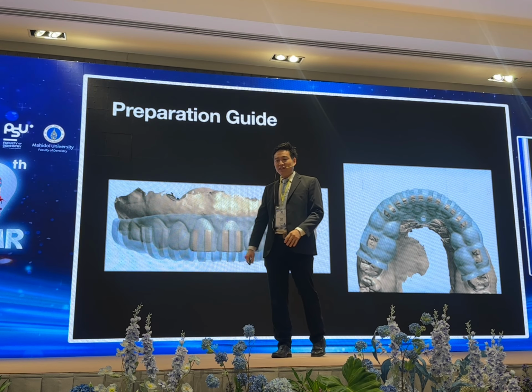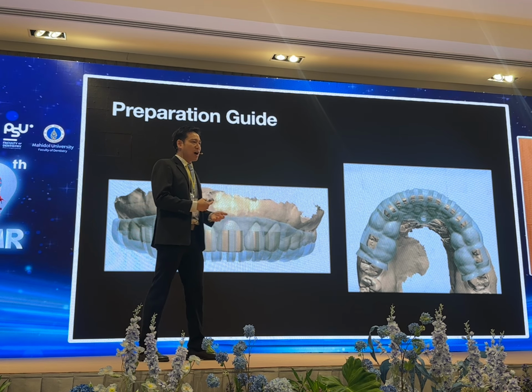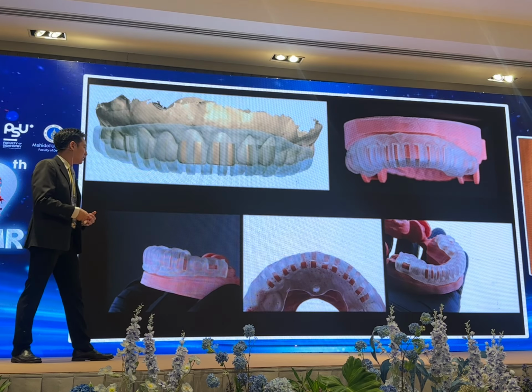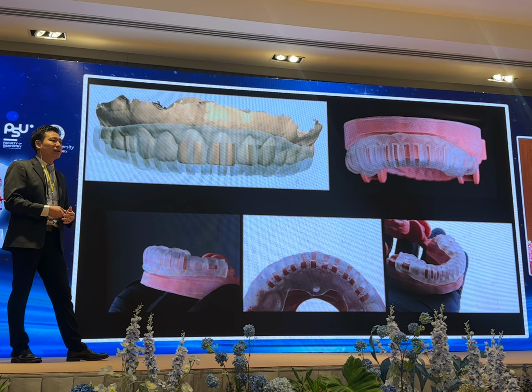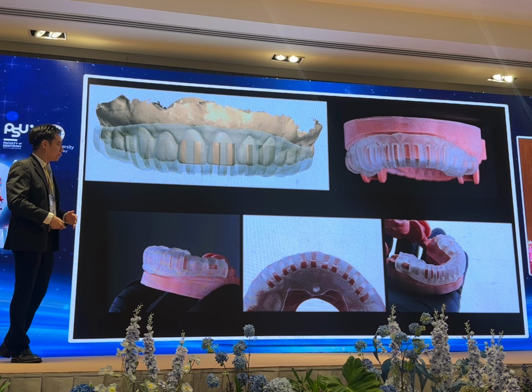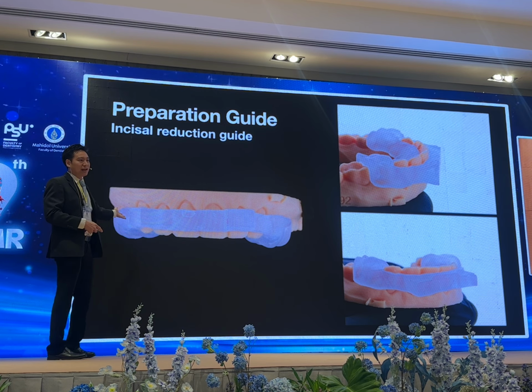With this guide, you can see where we want to go to the depth cut, how much we want to grind the teeth. We also print the model for verification and as a backup too. Not only the preparation guide, we also have the reduction guide.